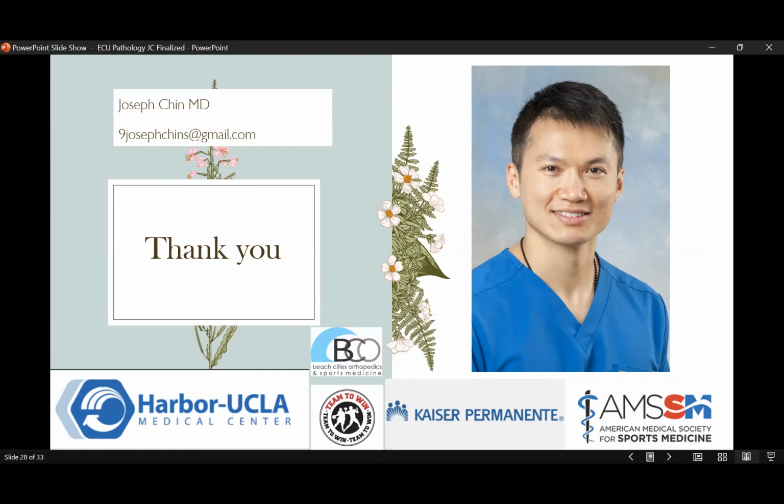And then really focusing in on the structures, we know that when people get into hypersupination, that subsheath becomes lax compared to when people are in pronation or even in neutral, which is what allows people to sublux a little bit, even in the setting of there not being a tear in that. So just making sure that you're assessing whether or not that subsheath remains intact as people go into supination, I think is very important.